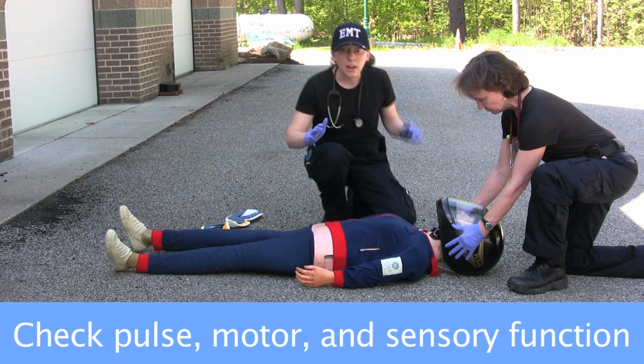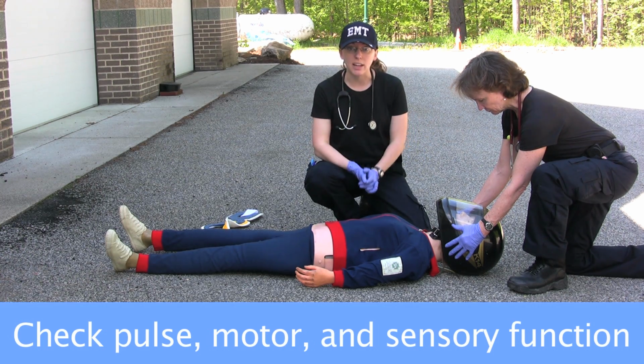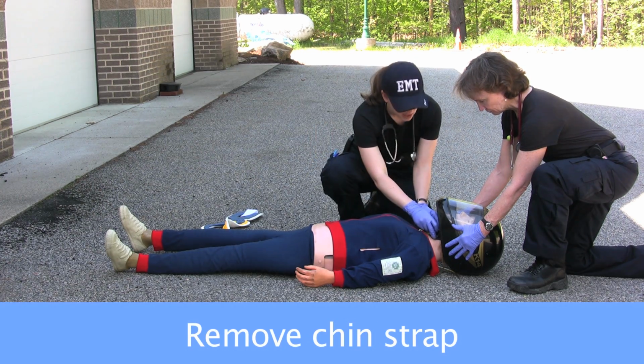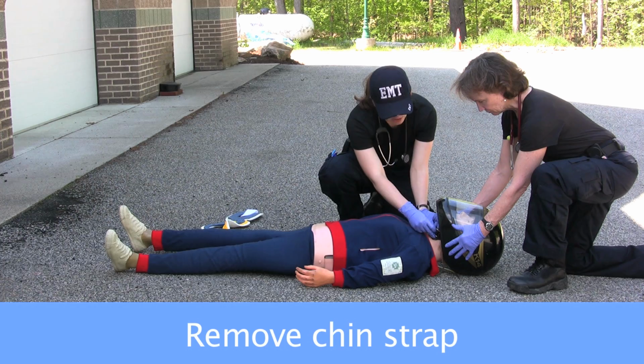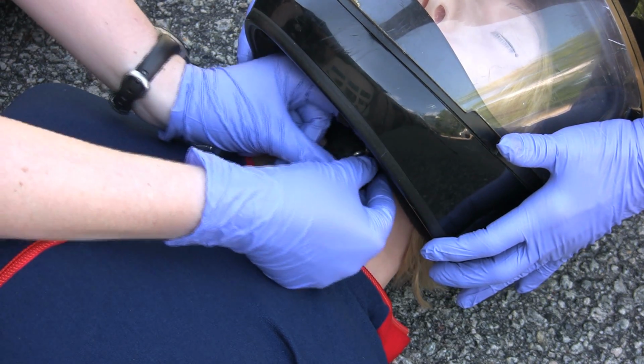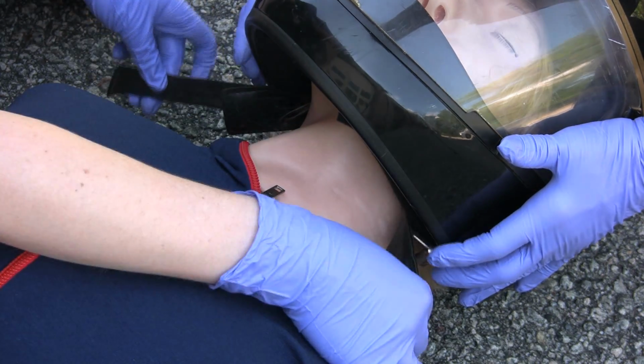So, now that the pulse, motor, and sensory functions are intact and we have a good baseline, I'm going to go ahead and remove the chin strap. Now, in an emergent situation, you just want to cut through this. But for this demonstration, we're going to nicely remove the strap.